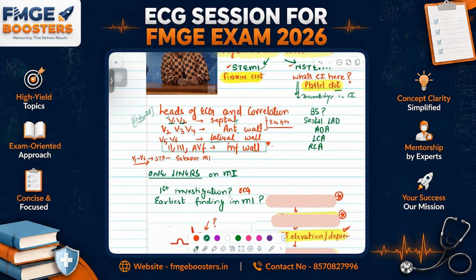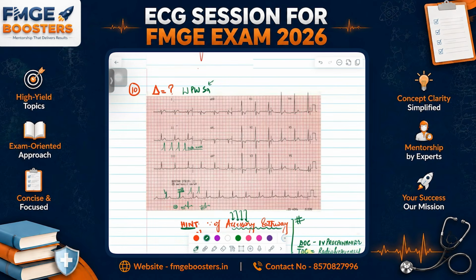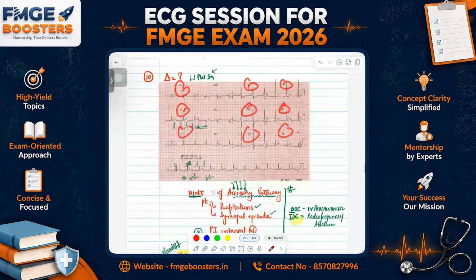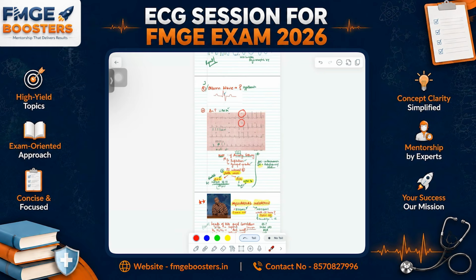Now we want to know the ECGs and the leads. Okay, we have V1, V2. ये थी ना यार, यहाँ पे देखो. We have 1, 2, 3, V1, V2, V3, V4, V5, V6. Okay. Now we have to remember कि V1, V2 tells us about what? If it is V1, V2, it means this is on septum of heart. V1, V2 will be on septum. Whereas V3, V4 and V2, these three will be on anterior wall. Guys, समझ आ रहा है? This is थोड़ा learning वाला part, but just remember that V1, V2 means septum, V2, V3, V4 means anterior wall.